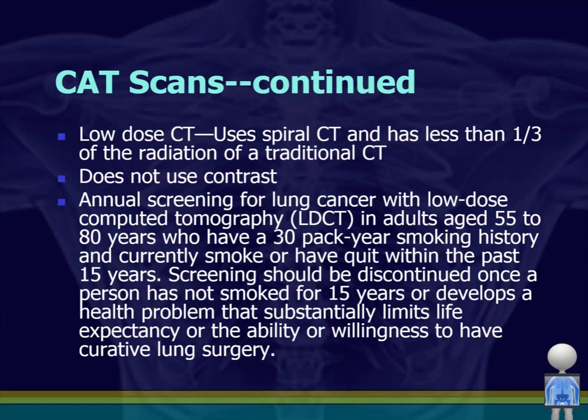Low-dose CT is something we should consider mostly for screening here. So this is a newer thing. The new guidelines state, as it says here for you guys, annual screening for lung cancer with low-dose CAT scan is for anyone 55 to 80 years old who has a 30-pack year smoking history and they currently smoke or they've quit within the past 15 years. So every year they do a low-dose CT. Now it's low-dose because we cannot radiate people on a regular basis, or we do increase their cancer risk. And I do want to tell you just one thing as a side note.